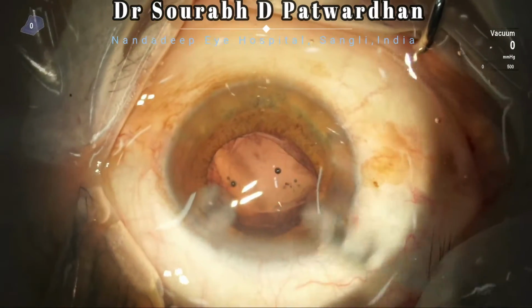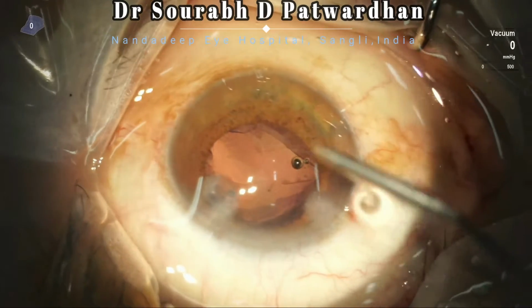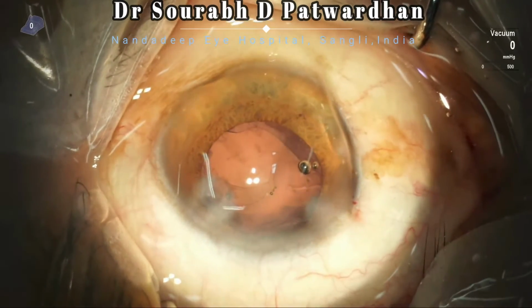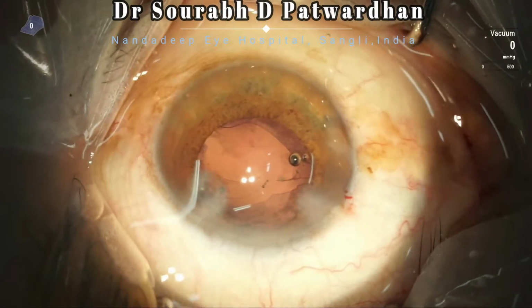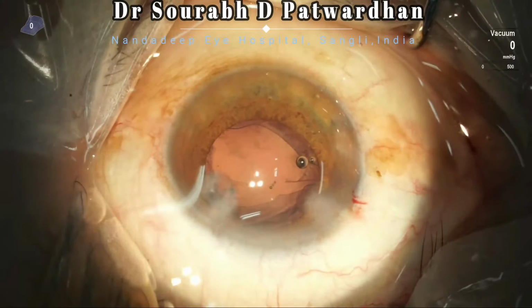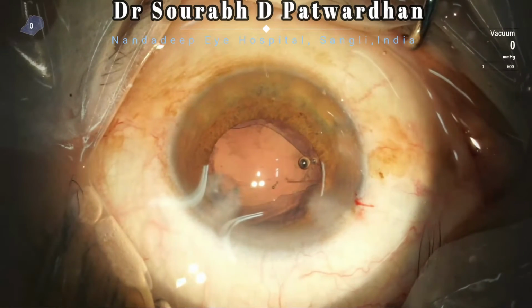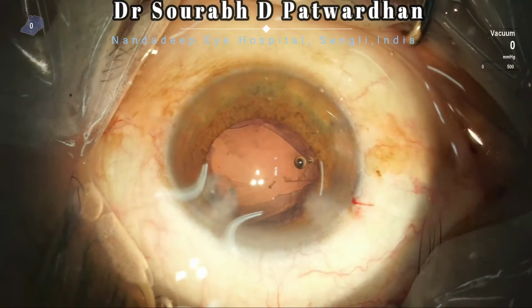So in such cases, it is better to keep the AC on the shallower side. A little bit of surge is welcome. Use Hylucoat or Viscoat to protect the endothelium throughout the procedure. If you want, replenish it in between so your endothelial safety is not compromised.